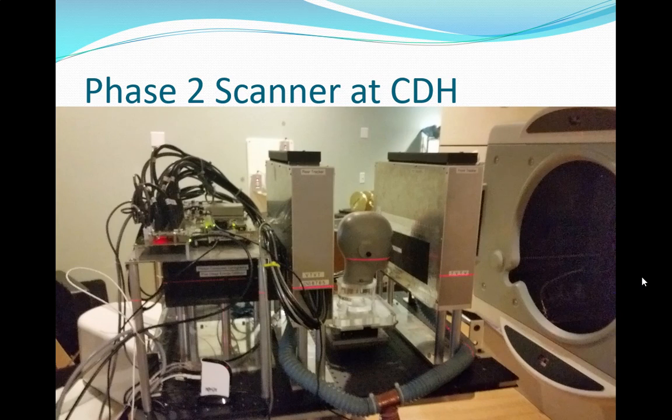If you have an optimal treating distance, you'll see the vertical. You can see that here. You'll have lasers that mark that. Here's the start of your treatment. You don't want to be closer than this, and they'll have one on the back. You don't want to be further than that. There are lasers all over the place whenever you go into these. They're all line lasers, very precisely calibrated, so that you can line up, in our case, for research, and for doctors to have their patients lined up.